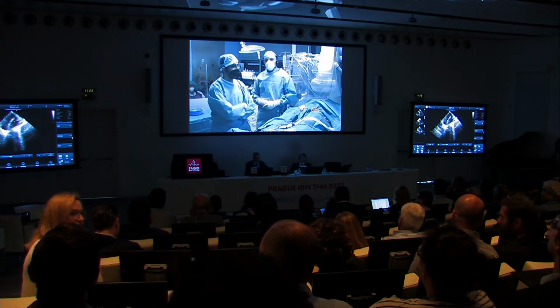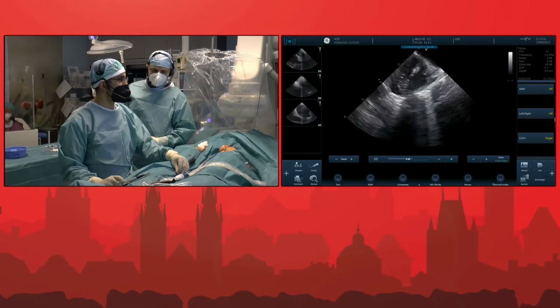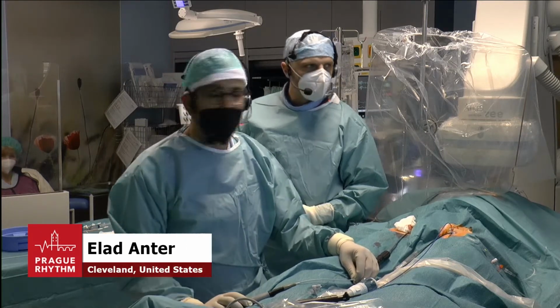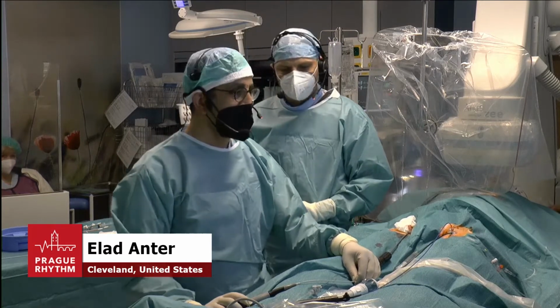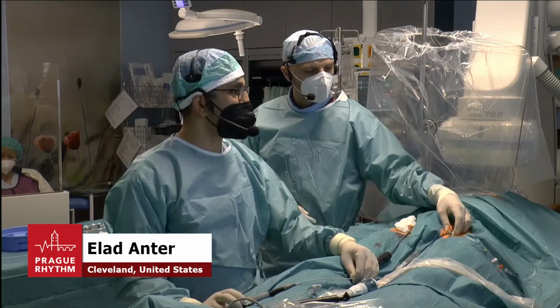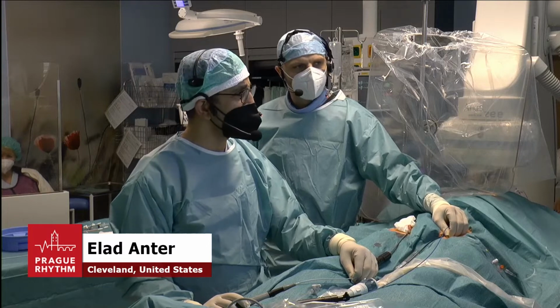Okay, so can you hear us? Great, so thank you for inviting me to work with you, with Peter and with Joseph. You got an introduction on the system yesterday with a very nice case in another patient with persistent atrial fibrillation. And you have seen a couple of demonstrations in lectures about the Affera system and the Sphere catheter that is designed for focal ablation using either RFA or PFA.